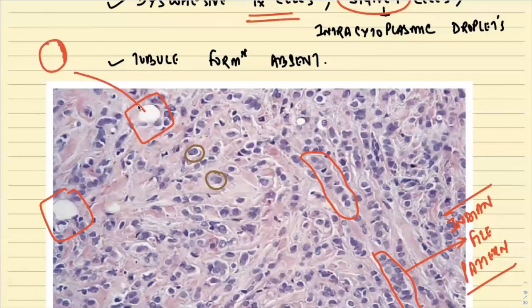Okay, this is your signet cell. Such kind of signet cell is also seen where? Yes, where are they seen? Gastric. They are also seen in your gastric carcinoma. Very good. They are seen in the diffuse infiltrative variety of gastric carcinoma as well.